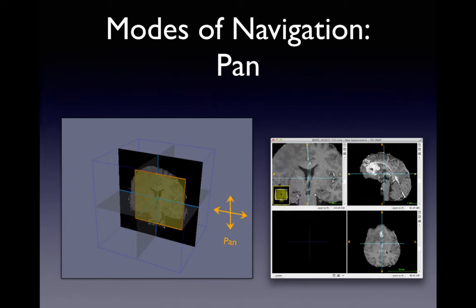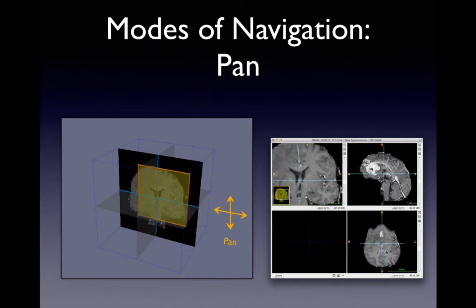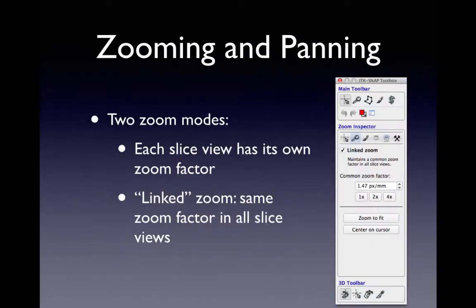And in addition to zooming, there's panning, which is basically keeping the zoom the same, but moving around the zoom box relative to the slice. So the four operations were out of plane, cursor changing, in plane, cursor changing, zooming, and panning.